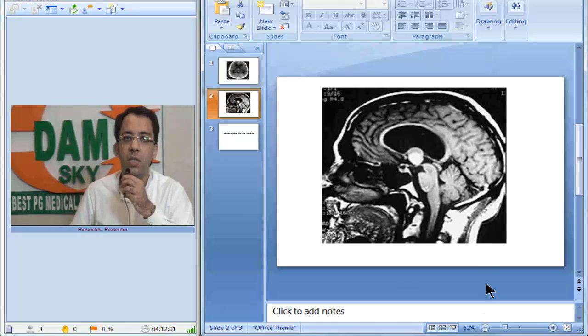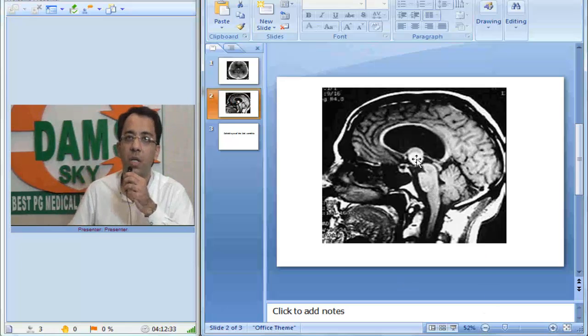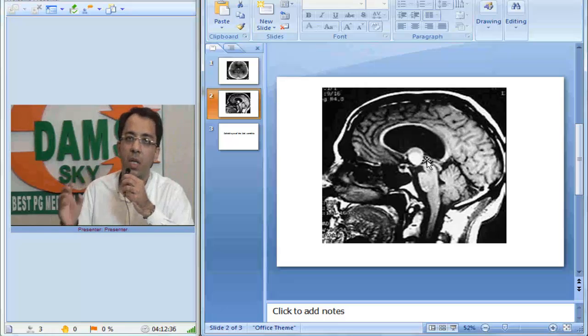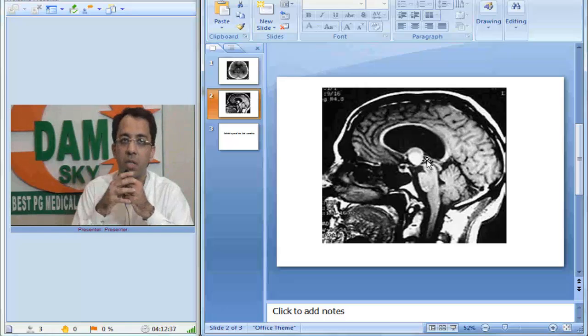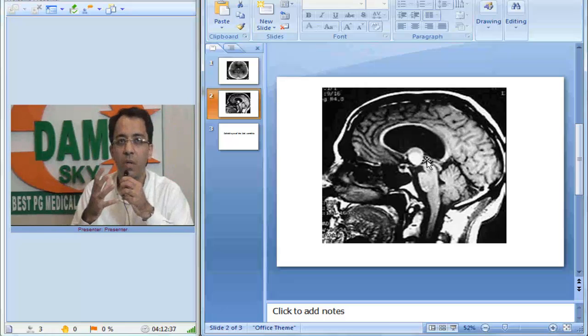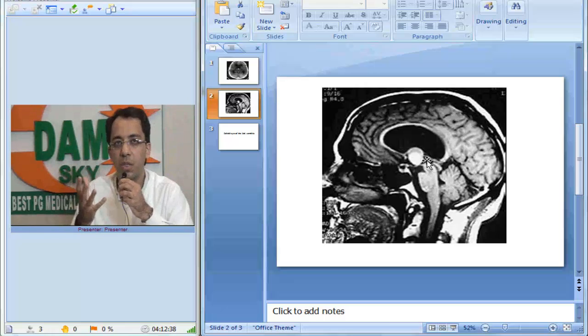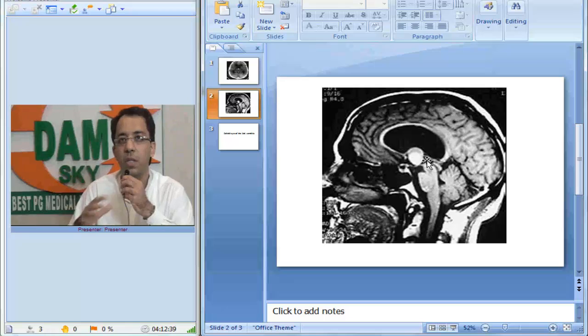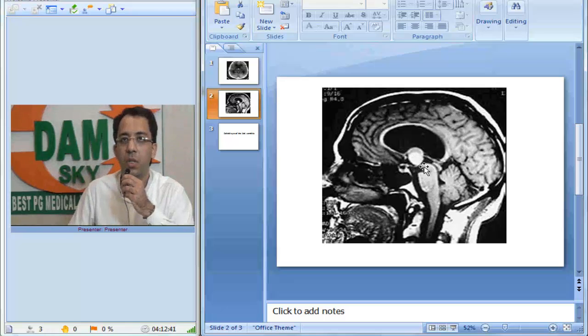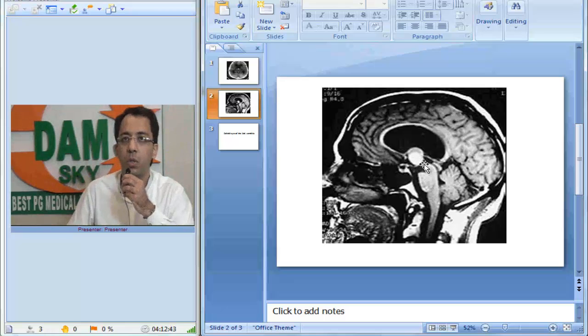this is where you will see, this is a T1 weighted MRI image and the signal intensity of this cyst is usually variable, but you may see it as hyperintense on T1 weighted image. This is the characteristic location of colloid cyst on a sagittal MR image.